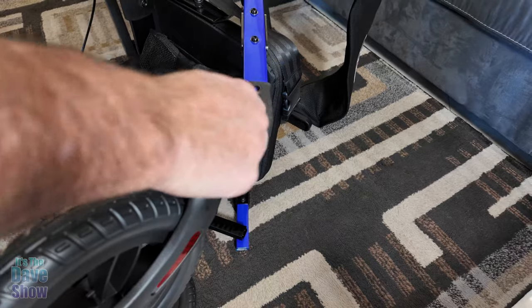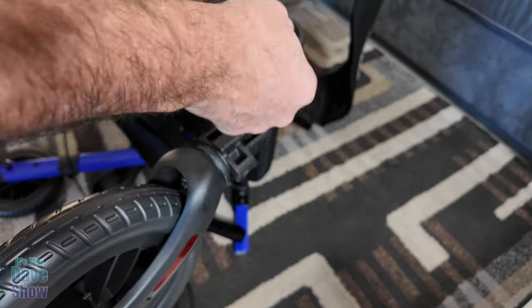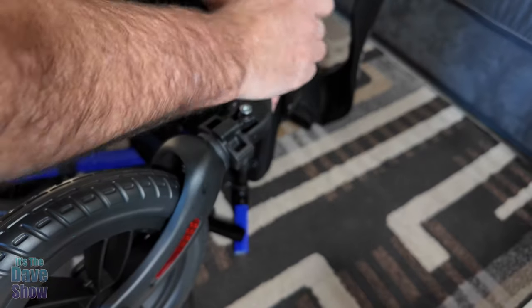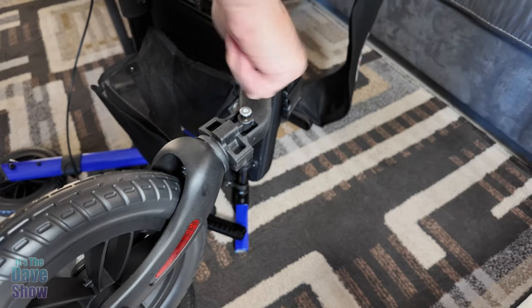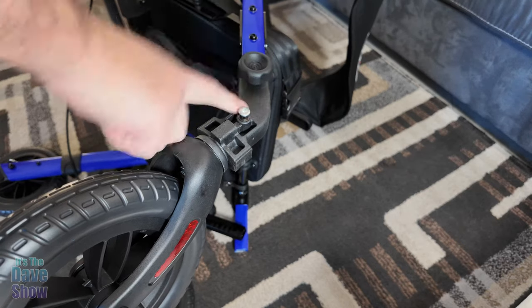Next we put the other wheels on. It has a bend, so you have to pay attention to that. The screw goes through the outside, so you want to make sure you're getting the right wheel on the right section. The pictures in the instructions are kind of vague so you do have to figure this out a little bit on your own, but it's not too hard.